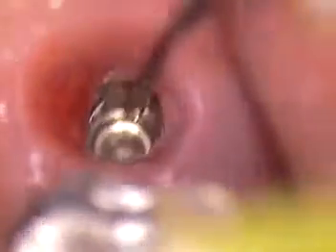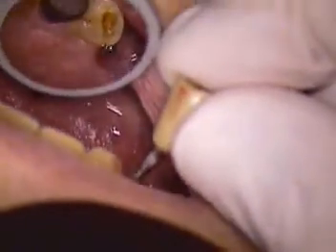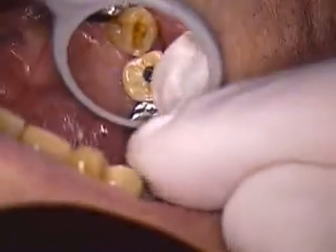Keep those threads happy, keep them clean. We've got a nice prosthesis going in. Back up our magnification, bring in our crown. Let's gently push this in place.